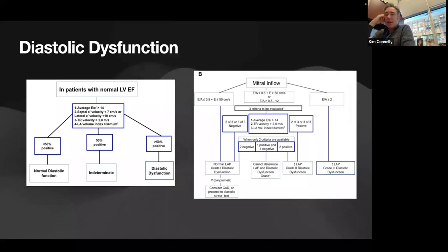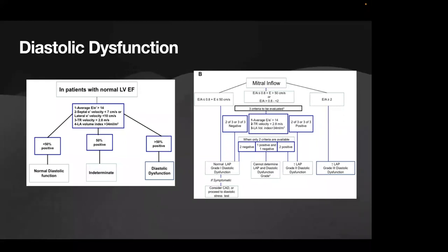It's sort of gone out of favor now because I think we've got a better integrated approach to look at diastolic filling, but you can still do it. There's no harm in doing the Valsalva and seeing if it changes, because it is helpful clinically, as that might suggest that you should increase your diuretic dosage and decongest further. So sometimes it is helpful.